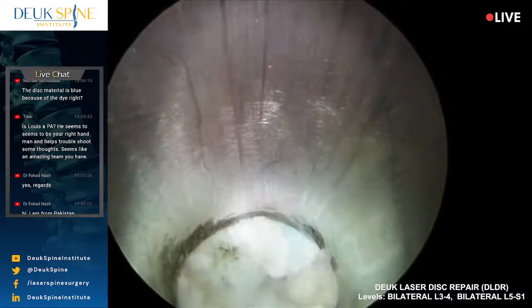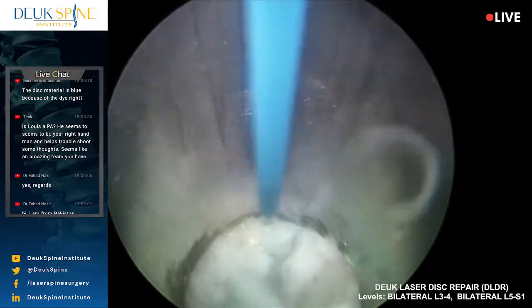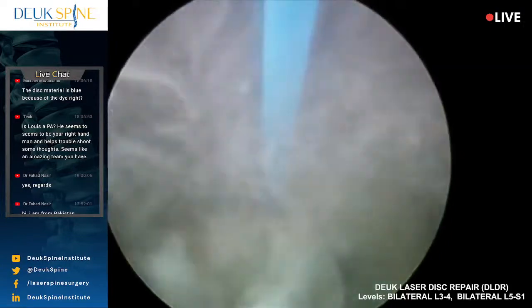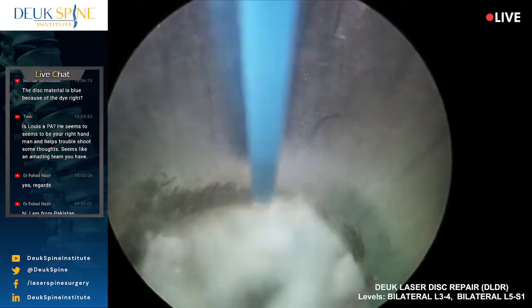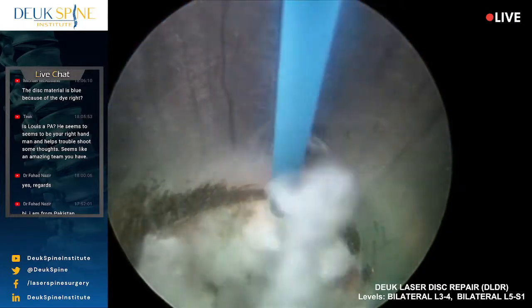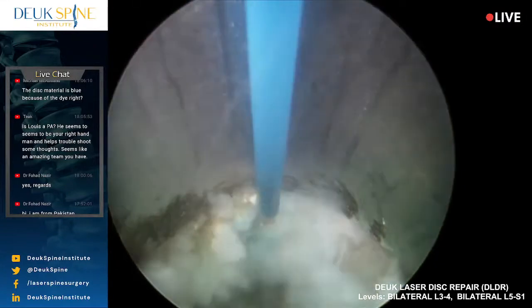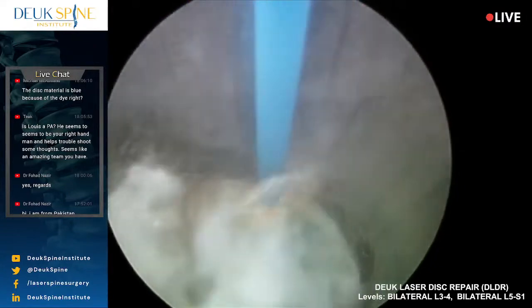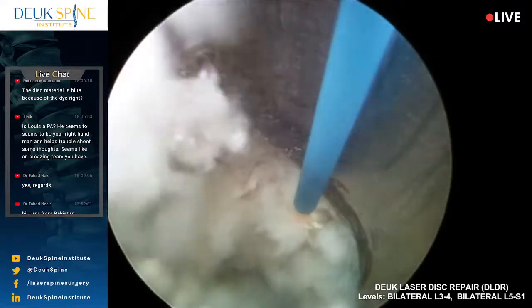How many joules have we used? Forty. That is a lot. It's not a record, is it? But it's close. Sixty-four on one disc? Twenty nineteen.